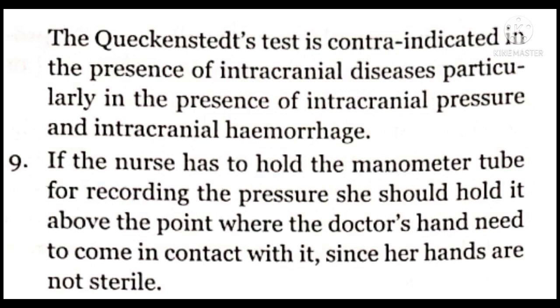9. If the nurse has to hold the manometer tube for recording the pressure, she should hold it above the point where the doctor's hand needs to come in contact with it, since her hands are not sterile.